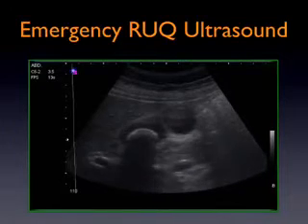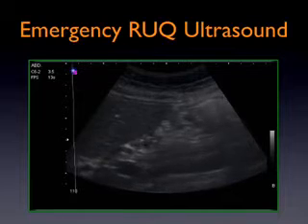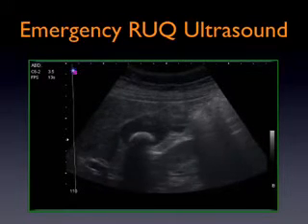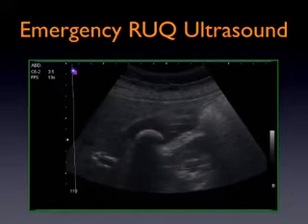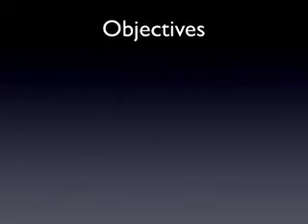Biliary ultrasound, albeit a more advanced bedside ultrasound modality, will serve to guide you with your abdominal pain workups and also to speed patient disposition. This lecture will discuss various facets of the right upper quadrant ultrasound.